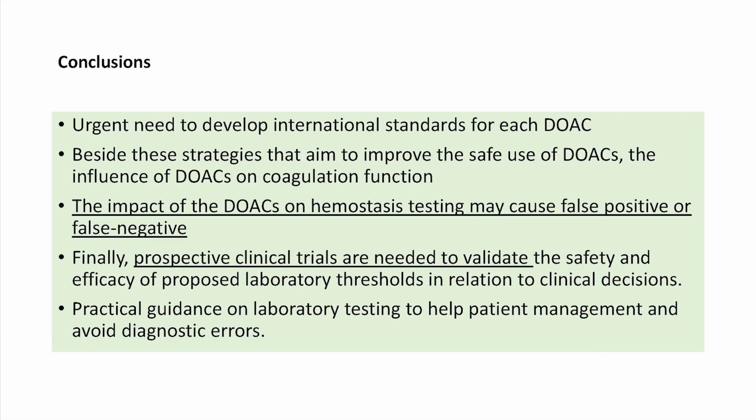It is very important to understand that there is an impact on hemostasis tests, leading to false positives of these tests. And there is a need for prospective clinical trials for validation and calibration of these tests.